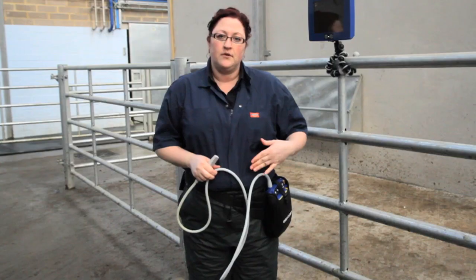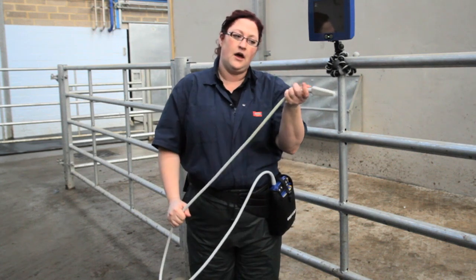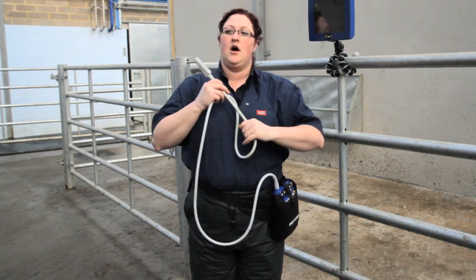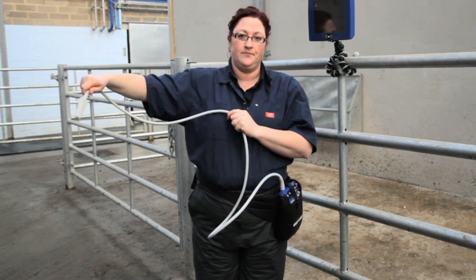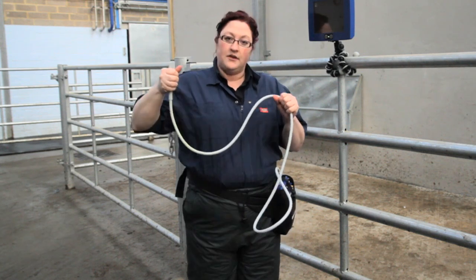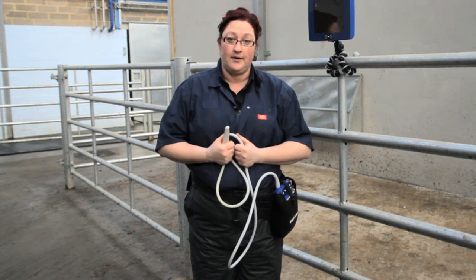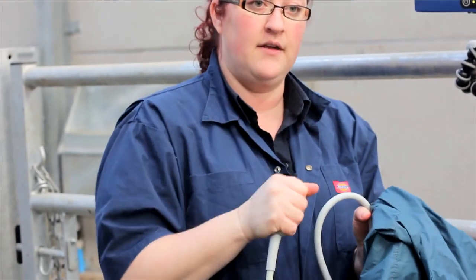So now we will put on a waterproof top, which will protect the console and also enable us to have faster cleanup, because we can actually feed the cable of the probe up and through the sleeve of our waterproof top. What this will allow us to do as well is to ensure that this end of the probe with the crystals is kept as close to our body as possible so that it won't become damaged. Palm the probe to ensure that the face doesn't get damaged.